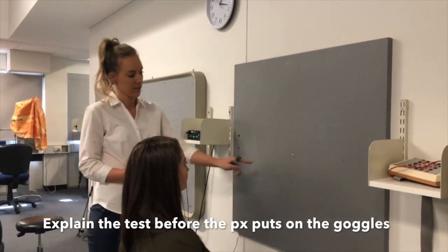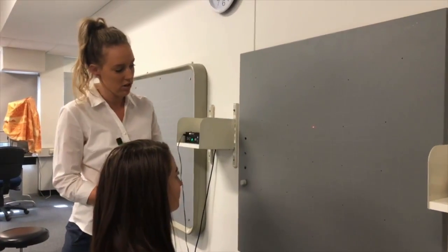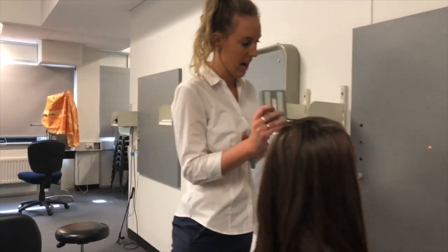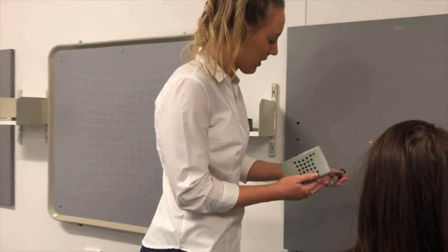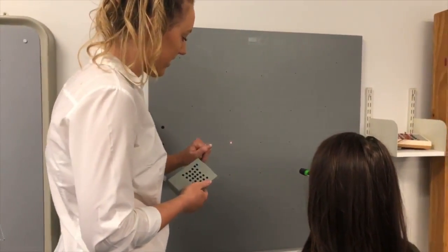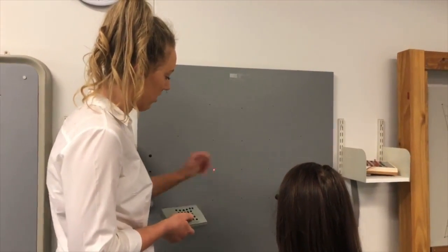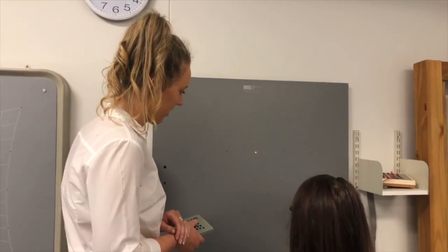Now what you're going to see, these red lights here, what they're going to do is they're going to come and go and they're going to move around on the chart. Now I'm going to control the red light. What I'm going to get you to do is you're going to hold this green torch here. Now as we go around, holding our head nice and still, I want you to move your eyes to get the green light on top of the red light.